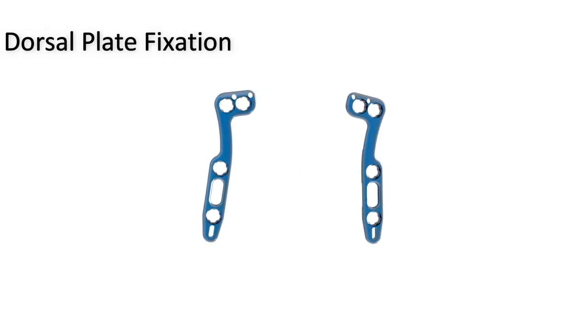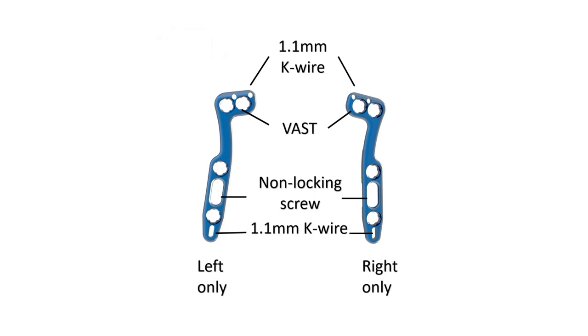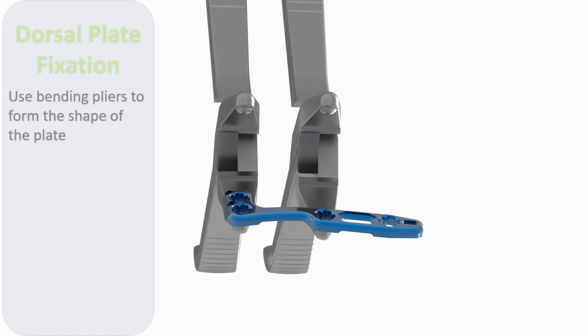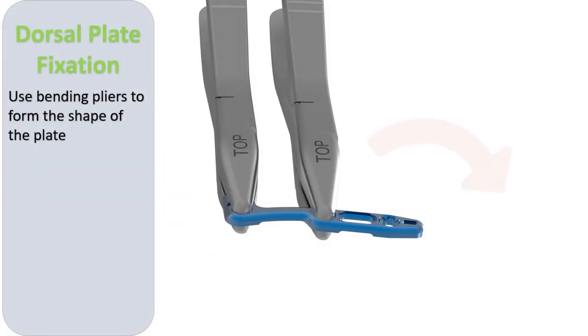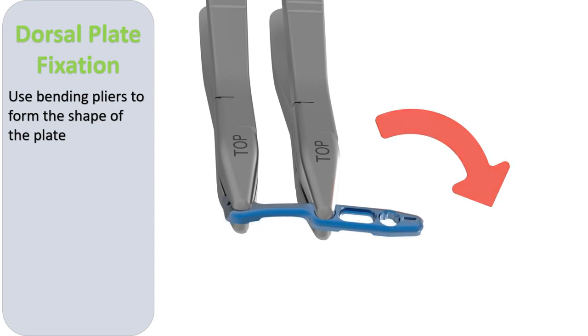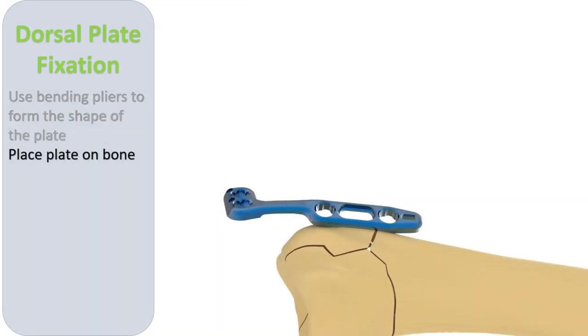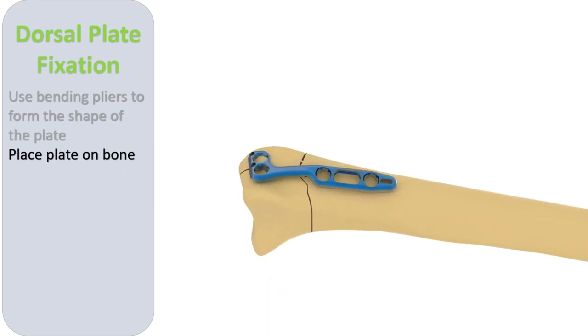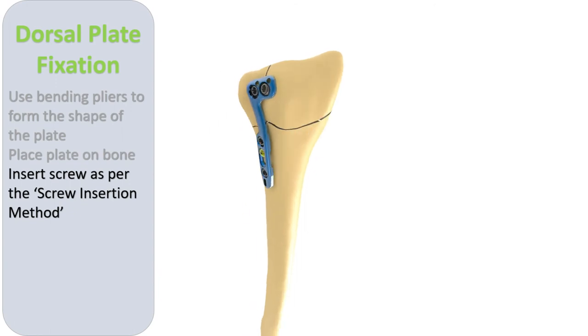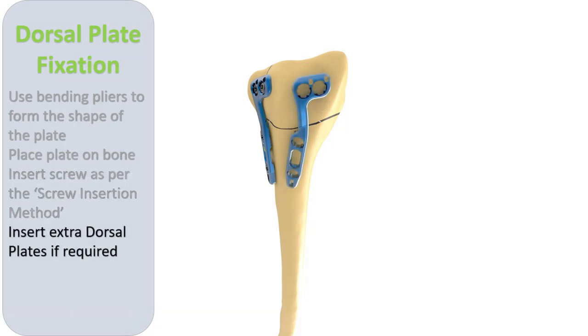Dorsal plates are angled right and left and can be used on either the right or left radius depending on the position and alignment required. Contouring as needed is facilitated by the bending pliers that maintain the VAST alignment of the screw holes. Further screw insertion uses a standard technique, and the two distal K wire holes may be suitable for complex fixation but can also be used to suture the plate to the dorsal capsule.